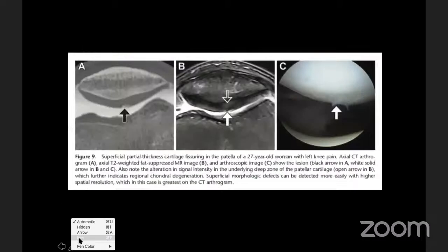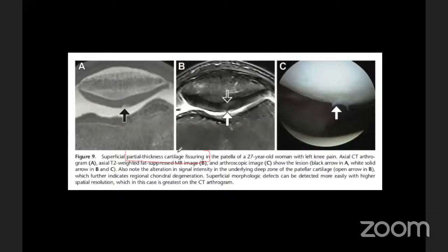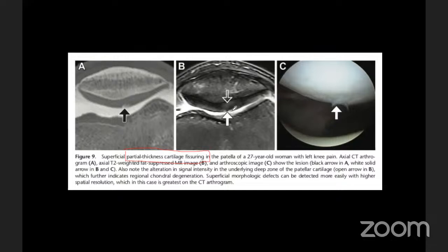Another example from the article is partial thickness cartilage fissuring. These are shown on CT arthrogram and MRI images alongside arthroscopy correlation. CT arthrogram beautifully identifies the fissure, but in India we cannot always perform arthrograms. On MRI, particularly PD-weighted images, you can pick up these fissures — thin chondral fissuring corresponding to what is seen on arthrography.